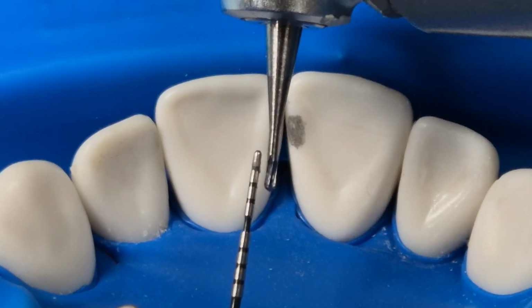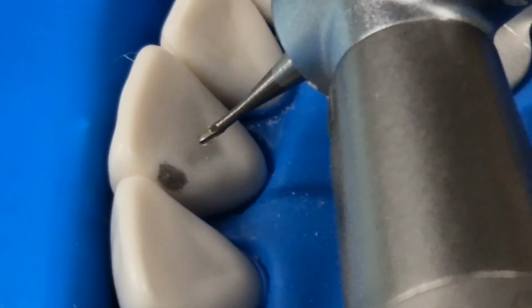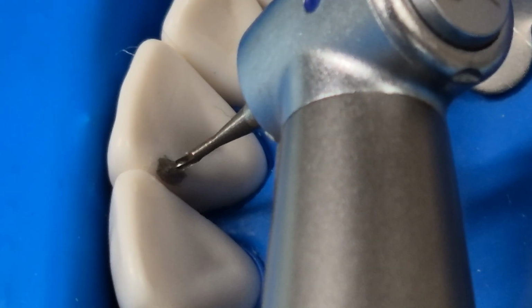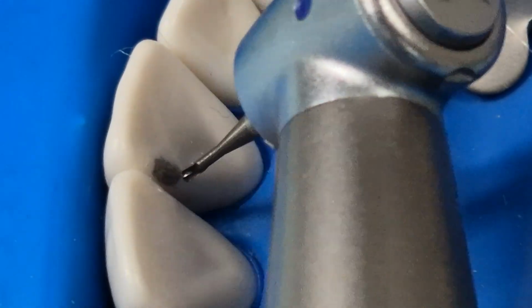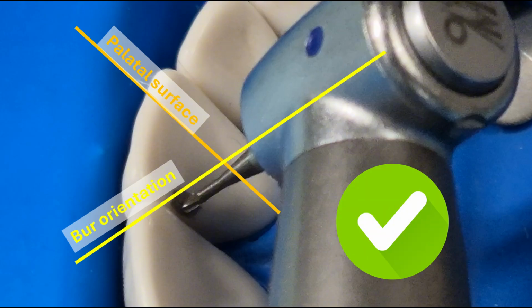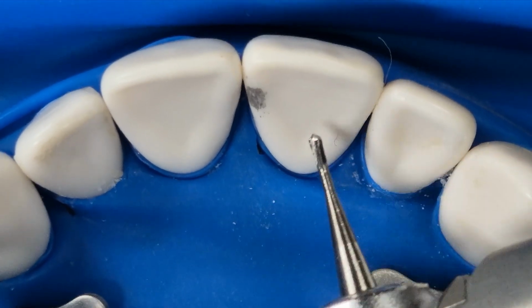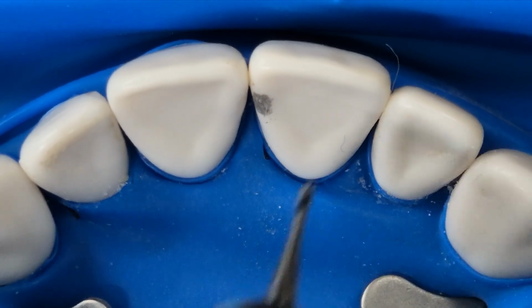And just like I did in the previous video, it's good to take note of the length of the 330 burr to help you estimate the cavity depth while preparing. And before drilling, it is crucial to orient the handpiece correctly. It must be vertical to the palatal surface of the tooth when looked at from the side view or proximal view. The handpiece must also be vertical when looked at from the incisal view and not tip too much towards the mesial or distal.